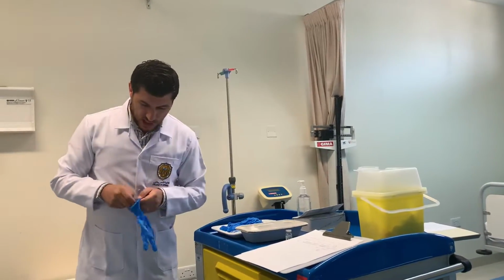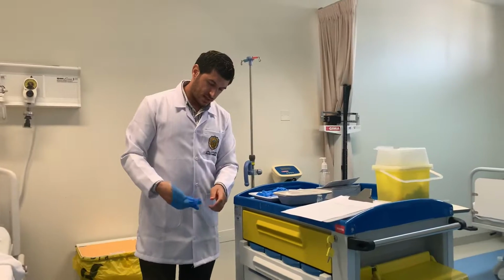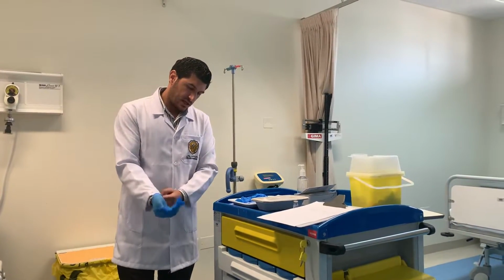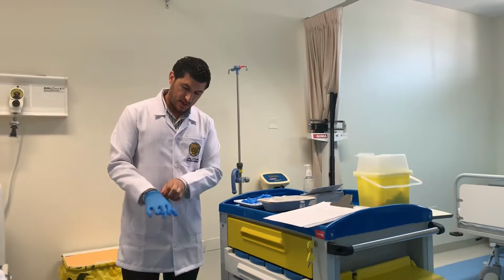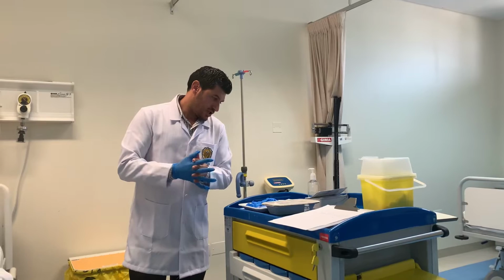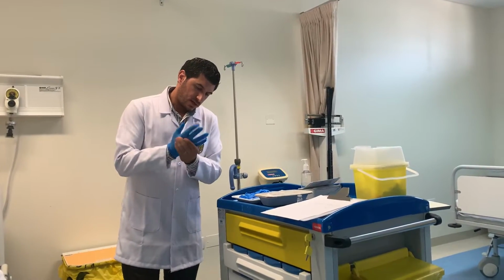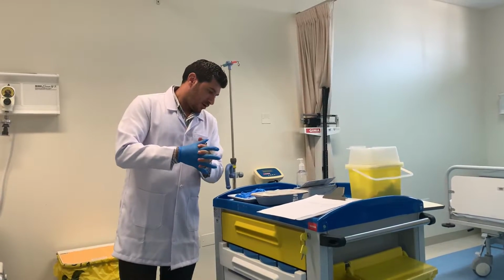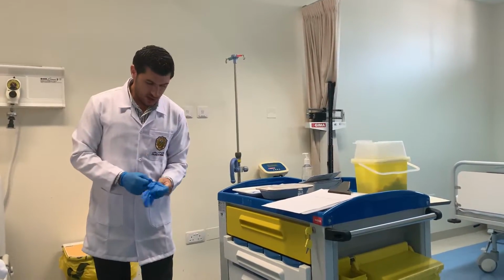So now we are putting on the gloves. We maintain privacy, check the patient ID, and check the patient's side and lab data for eligibility for the injection. I double check with my senior nurse and prepare my dose. Always make sure that you have checked the temperature of the medication.